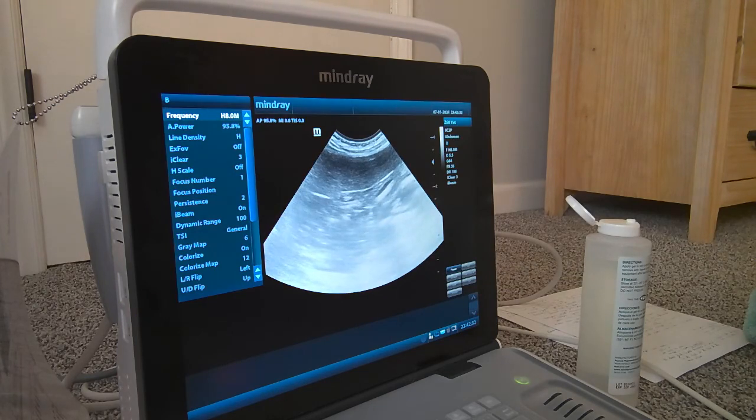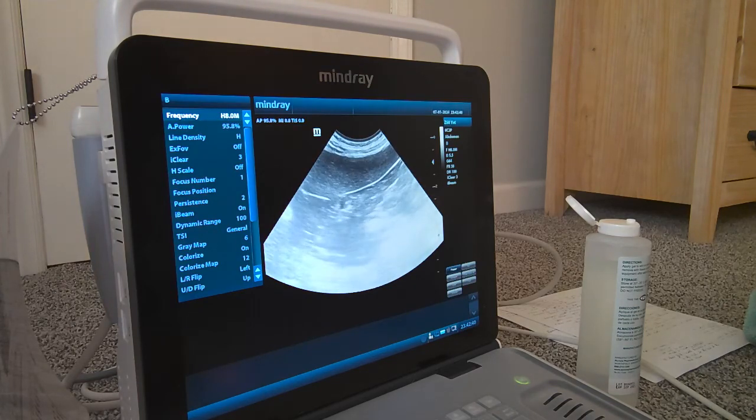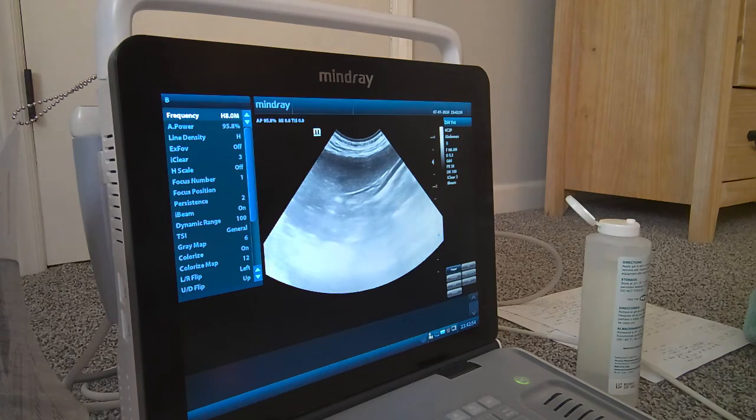We do see a lot of nodules. Again, just like the liver, a lot of our nodules are going to be very non-specific in nature. So if we see them, aspirating them would be a good idea. We can see things like nodular or lymphoid hyperplasia and extramedullary hematopoiesis, two big benign changes we see a lot. Then we will see metastatic disease or primary tumors like hemangiosarcoma, lymphoma, or other common things that we're looking for in the spleen.